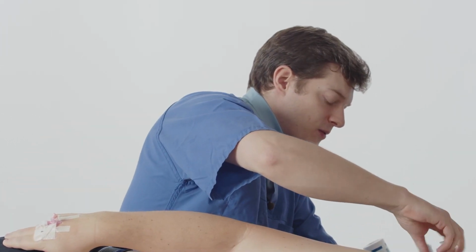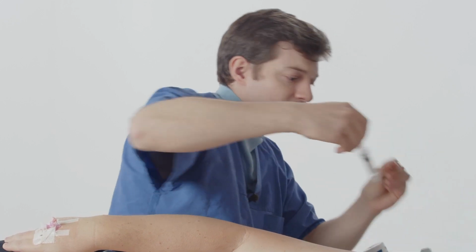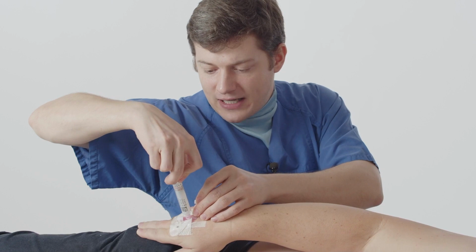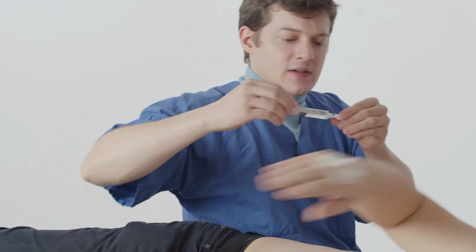And as we only have one patient today, we can attach it again. And normally you can have this for at least 5 to 6 patients. And danke dir.